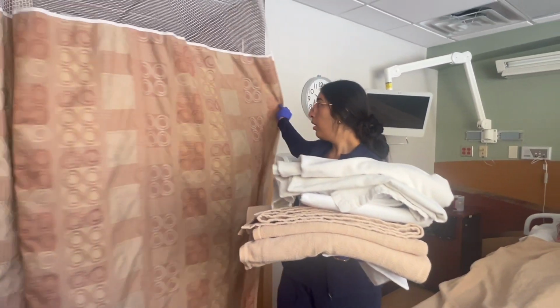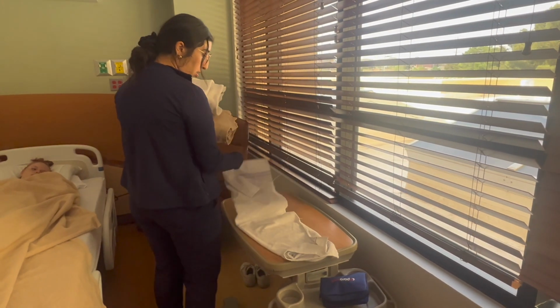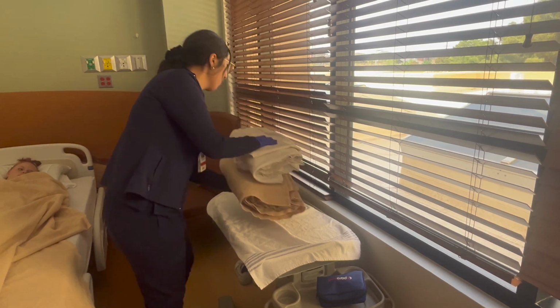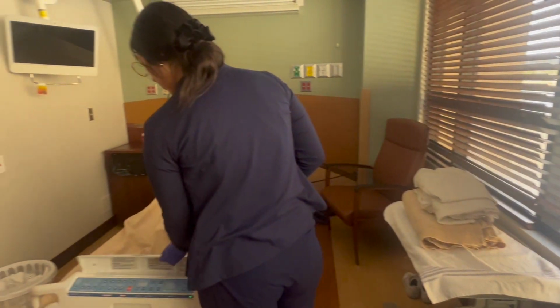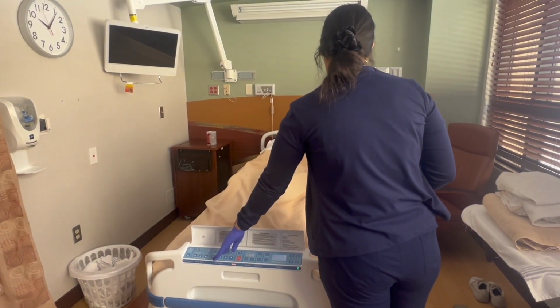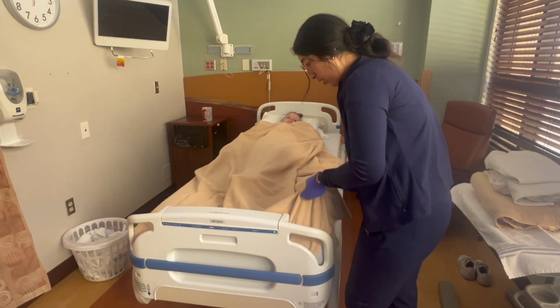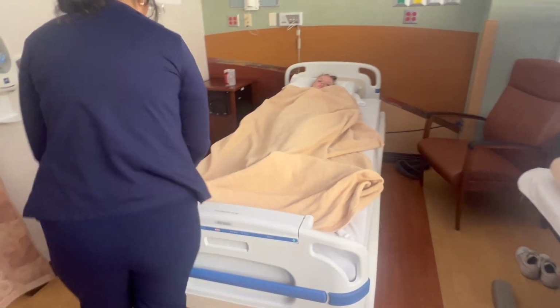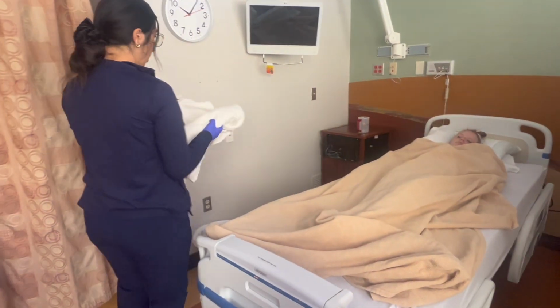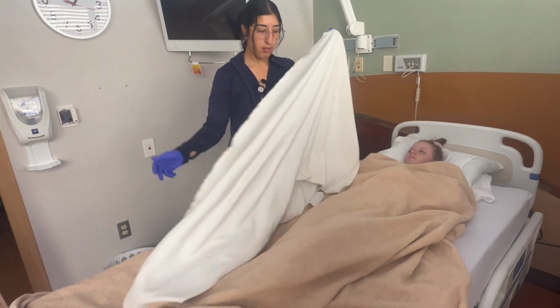I'm going to grab the curtain, pull for privacy, and then we're going to use this towel to not get our clean linens dirty on our potentially dirty table. I'm going to raise the bed. And I'm going to untuck this so it'll be easier to remove. I'm going to grab my bath blanket. I'm going to put this over the patient, not shaking it.